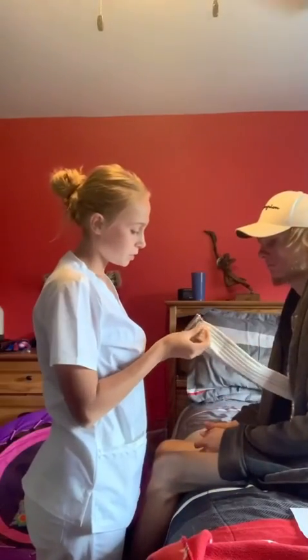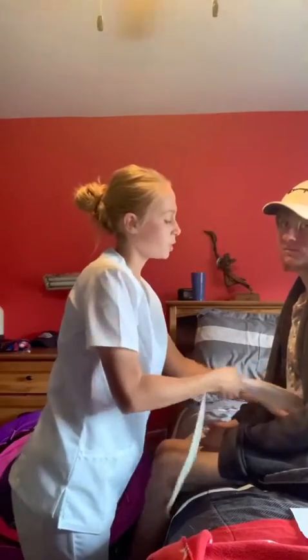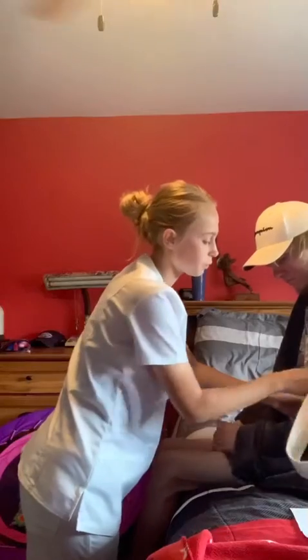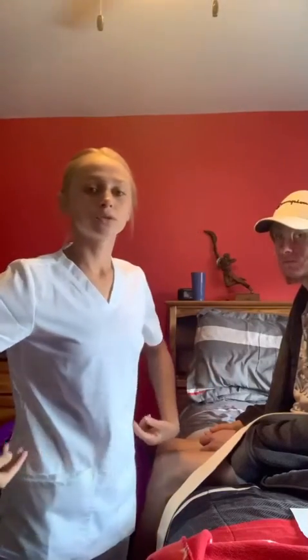Okay, so now we are going to apply the transfer belt, and you want it to be off-centered, and you also don't want it to be too tight, but you want it to fit snug, where you could only fit about 2 fingers inside of it. So also, when you are transferring, you want to either put 2 of your fingers underneath it on both hands and then lift the patient up, or you could put your more dominant hand on the back of it and your non-dominant hand on the side and then lift up.